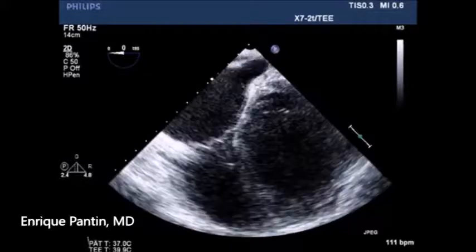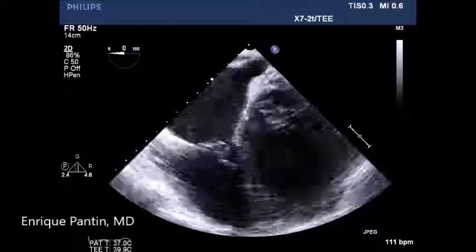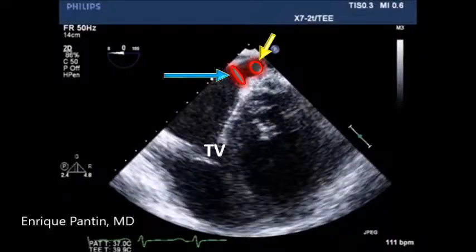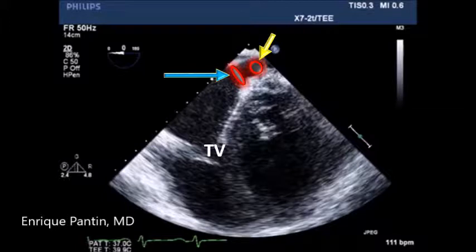A yellow arrow points to it. We will then be advancing the probe and we will see a small red circle with a yellow arrow — that's the entrance of the middle cardiac vein.